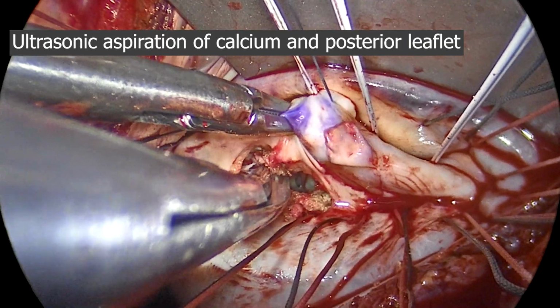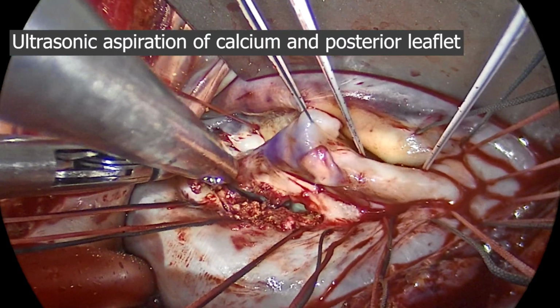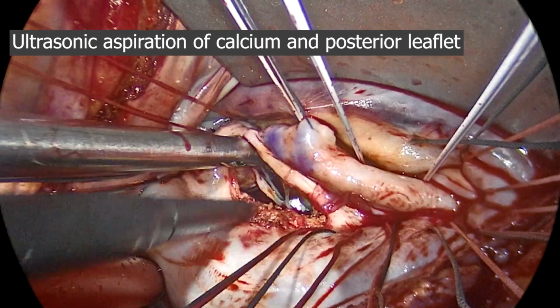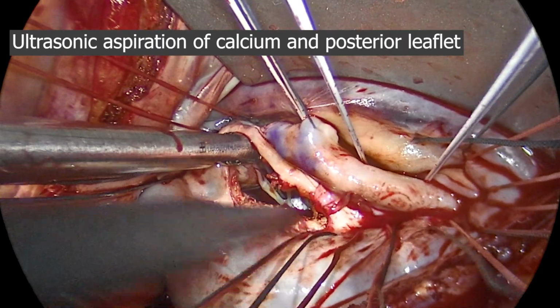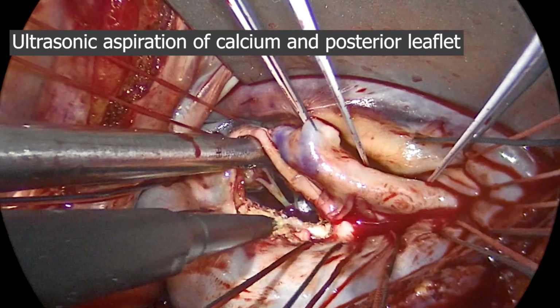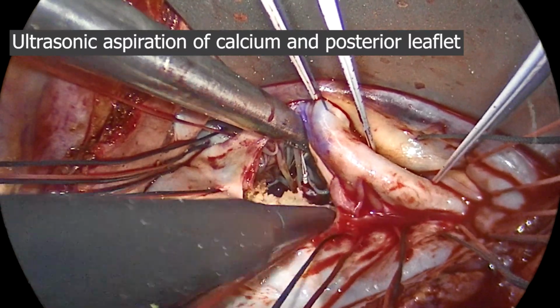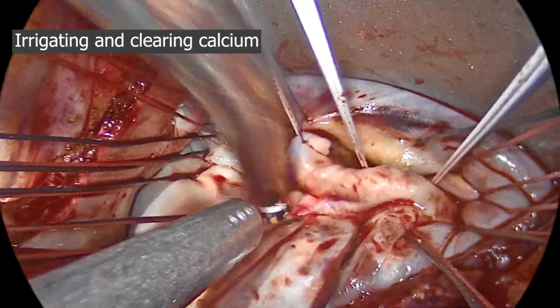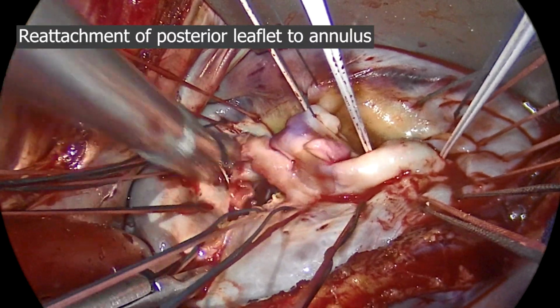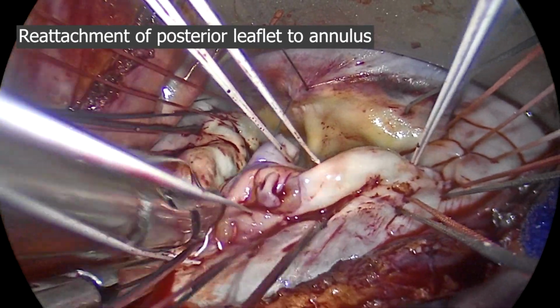We sharply remove calcified portions of the leaflet and affected cords. We now focus on removing calcium along the annulus. This is especially important for preserving valve integrity and for allowing reattachment of the posterior leaflet to the annulus. After ultrasonic aspiration, calcium fragments are irrigated and cleaned from the annulus. The posterior leaflet is then reattached using running 4-0 PTFE sutures in 2 layers.